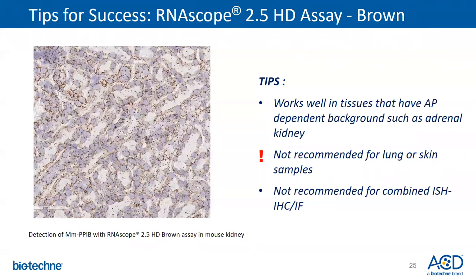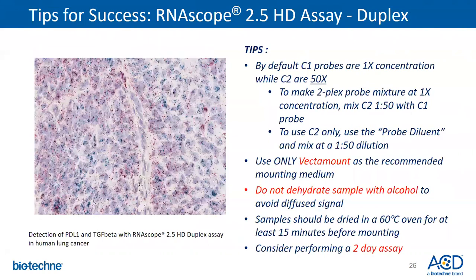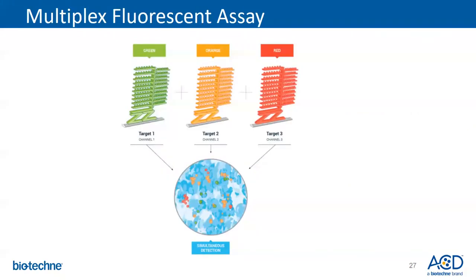And we say that the brown assay is not recommended for combined ISH and IHC. That's because if you're doing ISH followed by an IHC, you want to do your RNAscope first, then your IHC. And we kind of worry this brown assay uses the DAB chromogen, and DAB is physically fairly large. But honestly, I have people that follow this assay with IHC and it's fine, but just a consideration. And the duplex assay, I'm not going to go into this too much today. Multiplex fluorescent, you're able to visualize up to 4 targets in one sample at the same time.